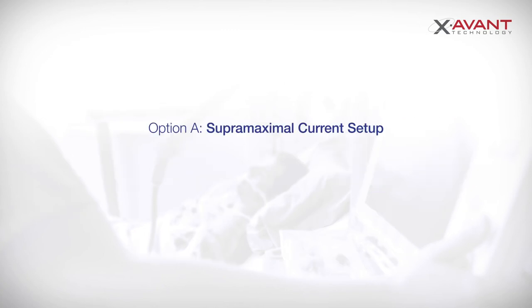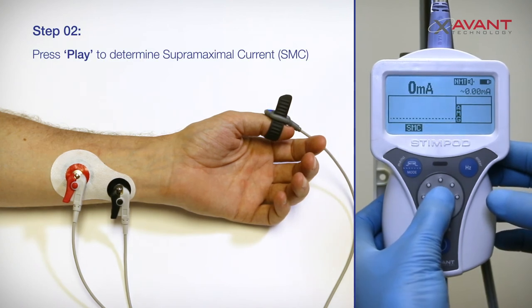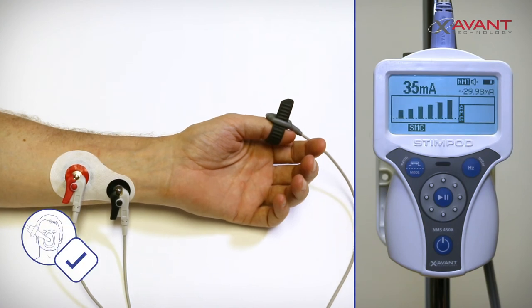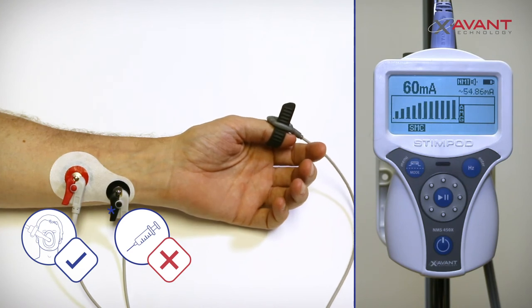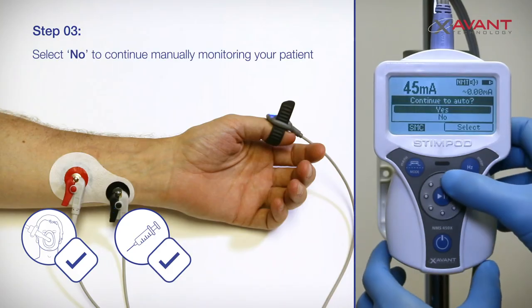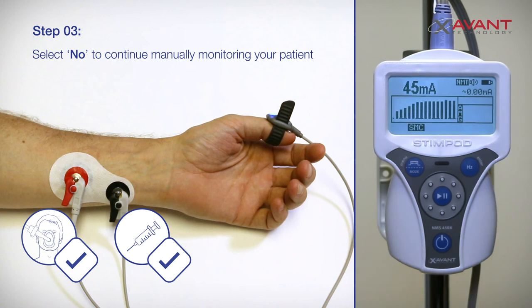Option A: Supermaximal current setup. Use the mode button to change the stimulation mode to SMC mode, then press play to initiate the supermaximal current. It is very important to make sure that your patient is anesthetized at this point but not paralyzed yet. The Stimpod will confirm your electrode placement and determine the optimal current for your setup. At the end of the sequence, the current will be set at the determined supermaximal current. The Stimpod will prompt you to continue monitoring in auto mode; use the scroll wheel to select no and press the enter button to confirm.